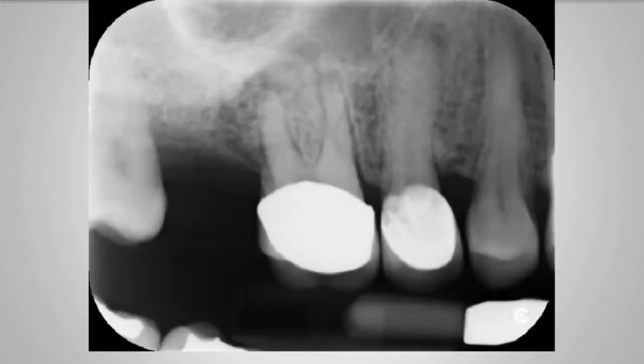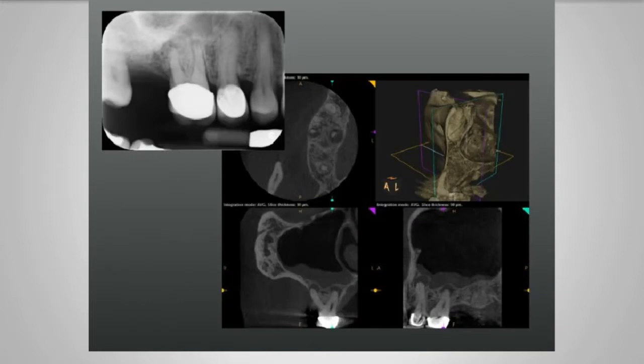Two-dimensional radiographs can be quite difficult to interpret, and certainly in endodontic practice we use CBCT quite a lot to help with diagnosis and treatment of root-treated teeth. Now this radiograph shows two teeth with potential radiolucencies, but they're not particularly clear. This is quite common because until most of the cortical plate has been eroded, you often don't see the lesion on a radiograph. Now the CBCT of these same teeth shows quite clear periapical radiolucencies.